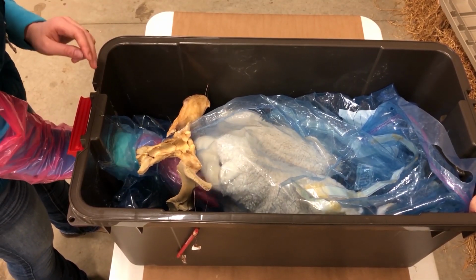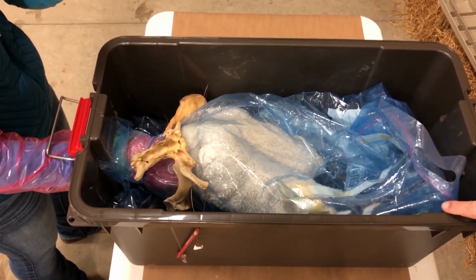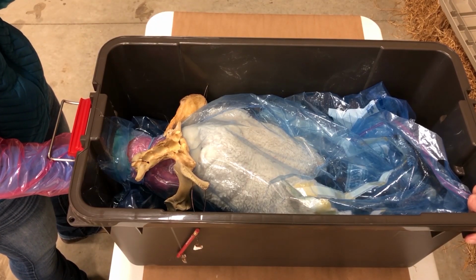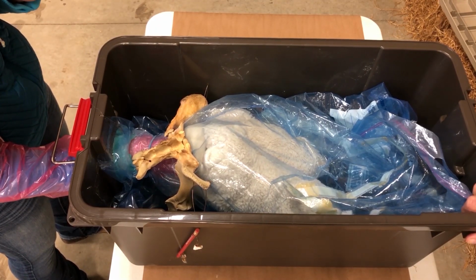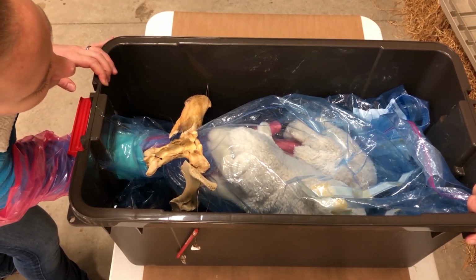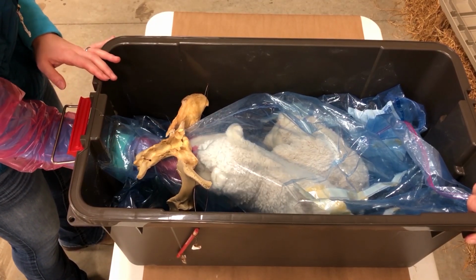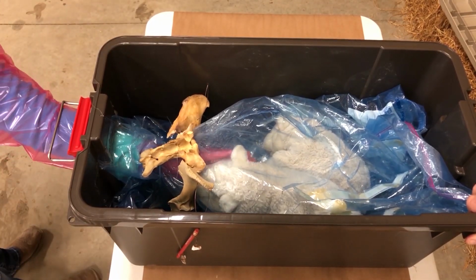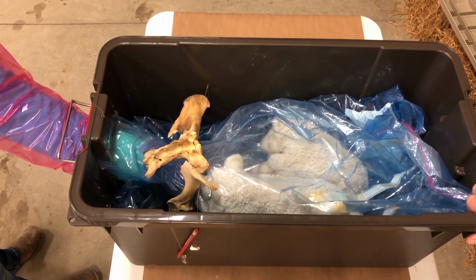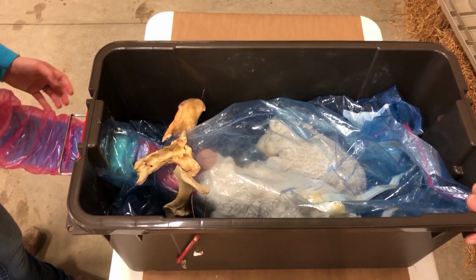So when I'm in this situation, I want to go ahead and number these lambs. The one with the head, I'm gonna number 1, and the one with just the leg, I'm gonna number 2. So I'm gonna push lamb number 2 back if I can, as much as I can. And I'm gonna be sure I've got head number 1. I still have that leg number 1. And now I'm gonna go ahead and reach down and I'm gonna follow this head and try and get this second leg as much as I can and get that one popped up here so that I have both legs and a head.